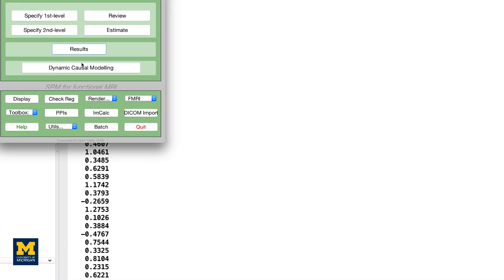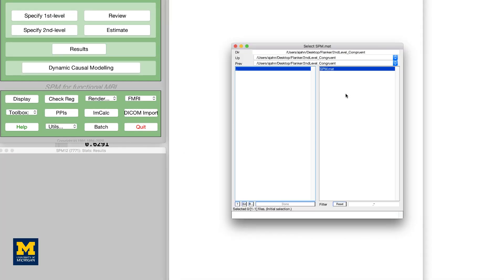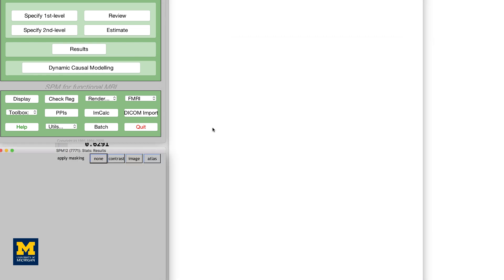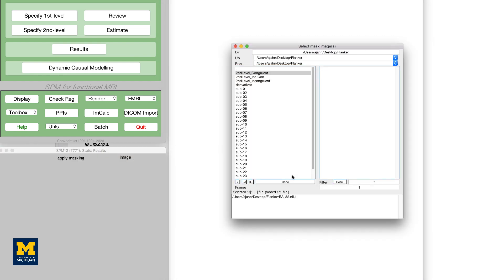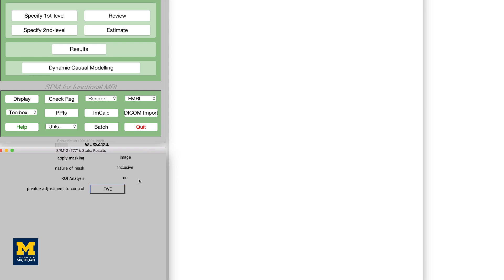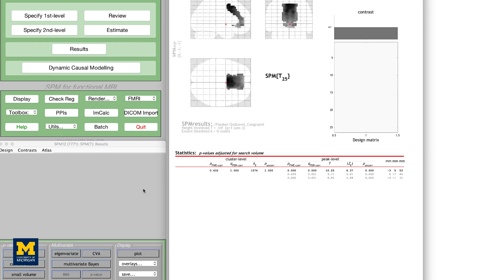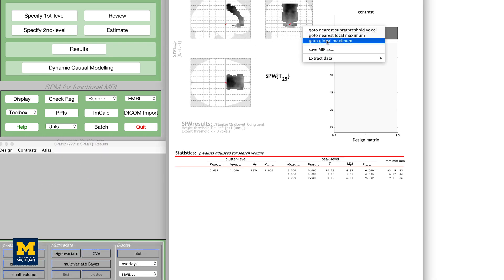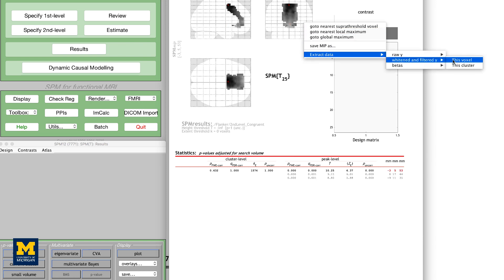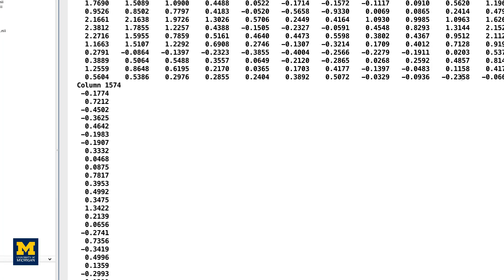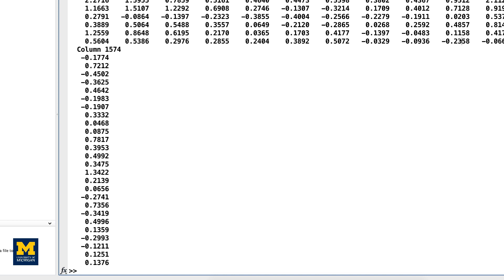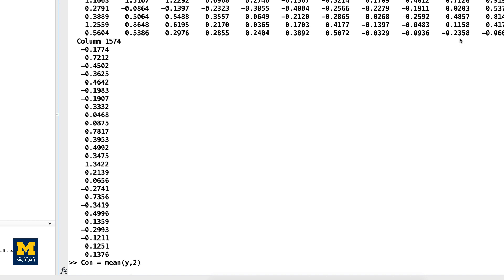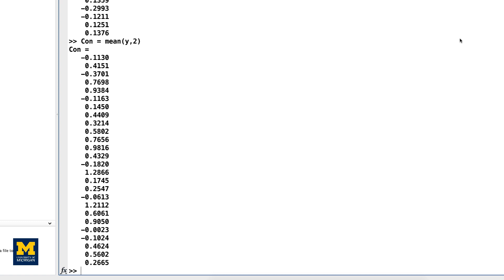We will now do the same procedure for the congruent contrasts, loading the spm.mat file from the second-level congruent directory and selecting the same options as before. When you have displayed the results within the BA32 ROI, extract the data, and then from the MATLAB terminal, type: Con = mean(y, 2). We now have a pair of 26 numbers, one pair per subject.